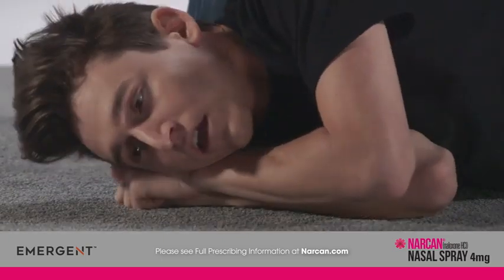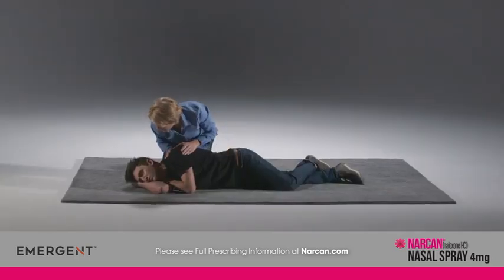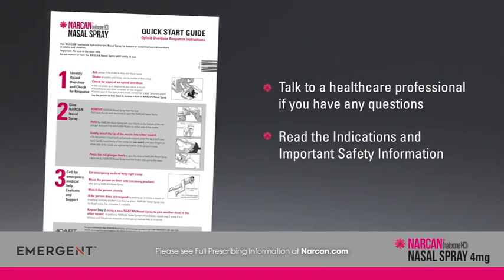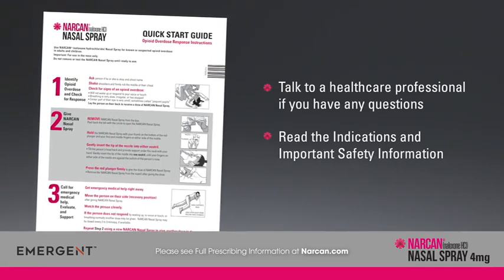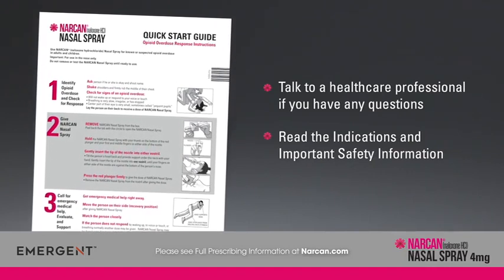When the emergency is over, put the Narcan nasal spray back in its box and throw it away in a place that is away from the reach of children. In addition to watching this video, please read the Quick Start Guide that comes with Narcan nasal spray before using it. Talk to a healthcare professional if you have any questions about how to administer Narcan nasal spray. Please read the indications and important safety information that follows.